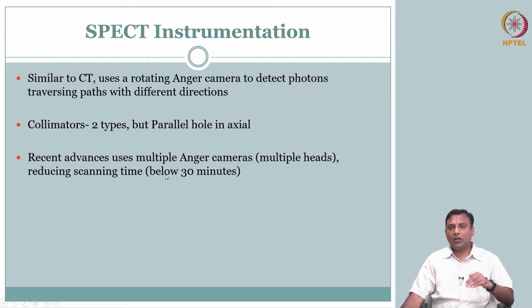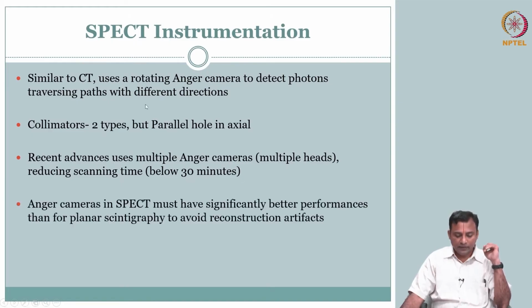But our focus will not be on all those. Those are extensions with brute force. We will be interested in seeing how we get one tomographic slice, right? One single photon emission computed tomography.